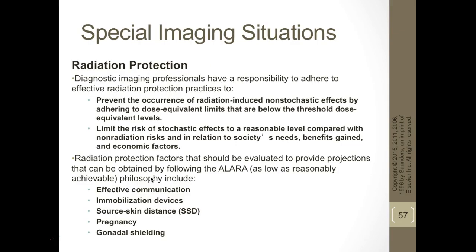Okay, so when we talk about radiation protection, we're talking about repeats here and ways to reduce the radiation exposure: through repeats, through collimation, through immobilization, through communication, through your skin doses, and how to reduce dose for a pregnant patient, and the proper way to shield.